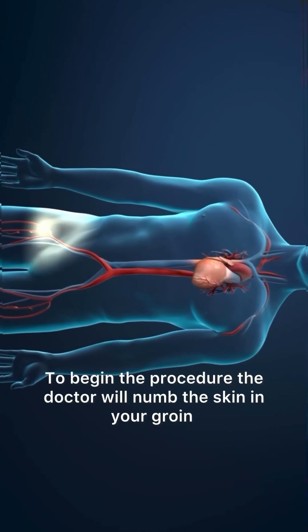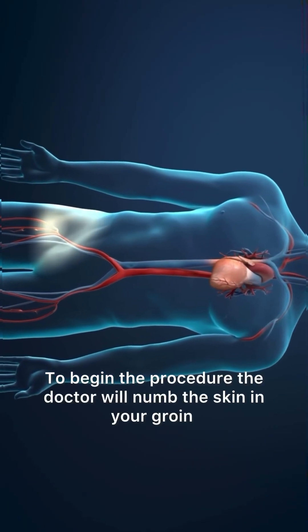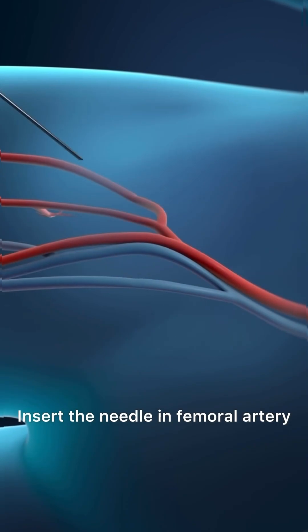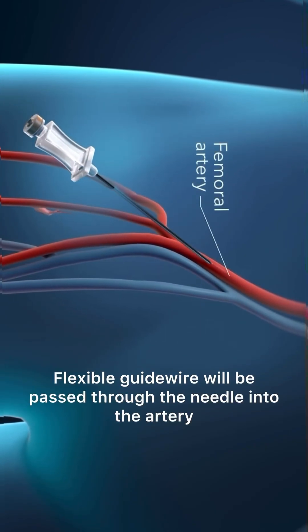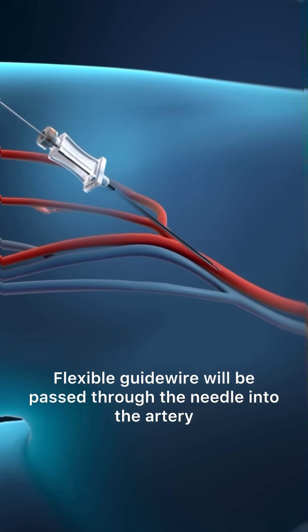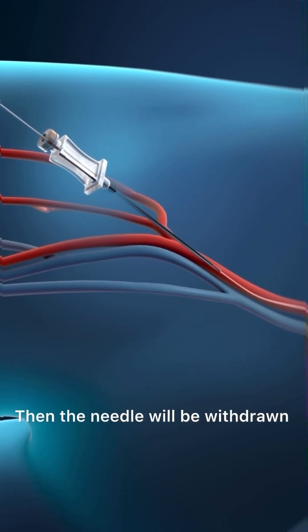To begin the procedure, the doctor will numb the skin in your groin, insert the needle in the femoral artery. A flexible guide wire will be passed through the needle into the artery. Then the needle will be withdrawn.